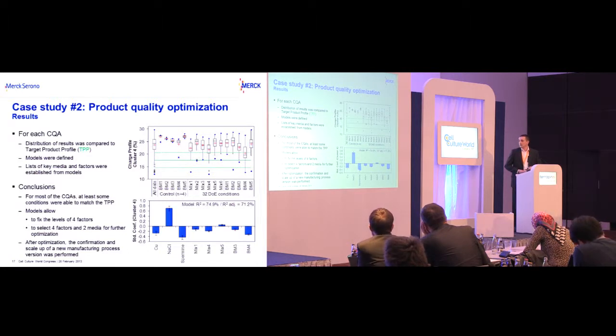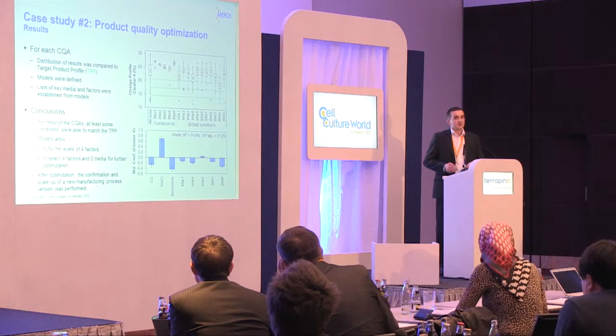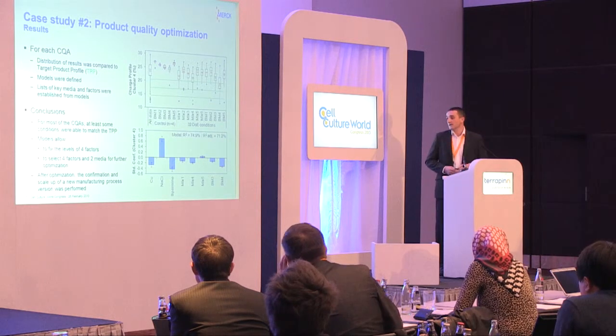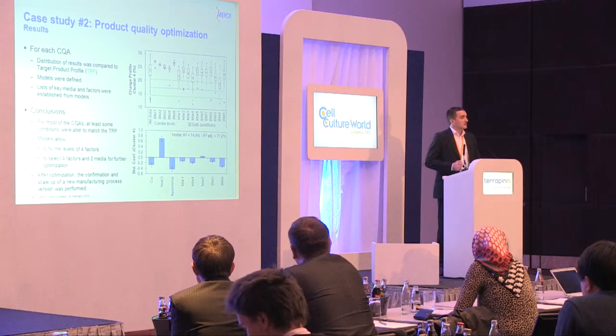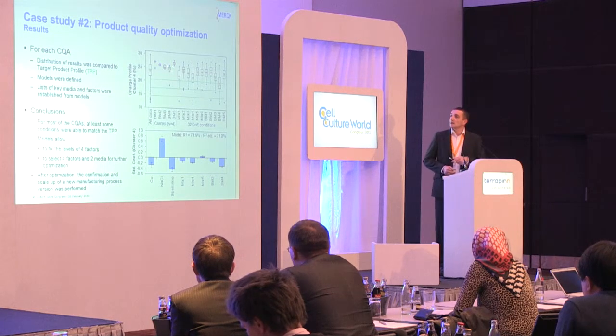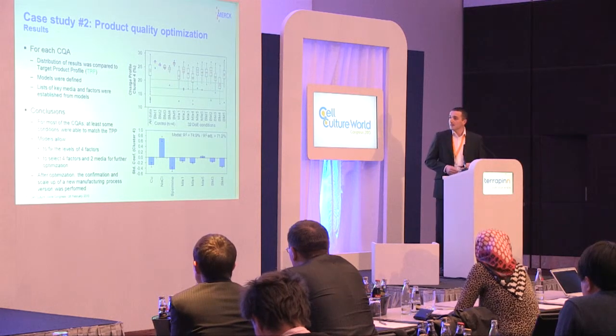It was the same with spermine, but with NaCl, it was not. So it means that we had to decrease the osmolarity of our feed. We have seen also some effect of the medium. For example, basal medium 4 was really interesting, providing a lower number of cluster 4 isoforms.